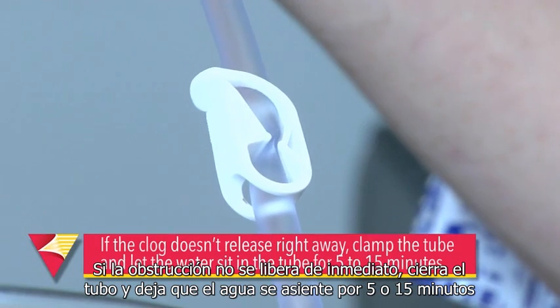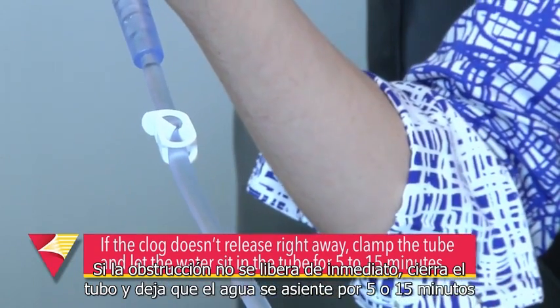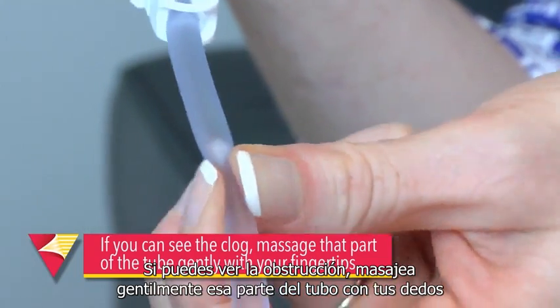Gently move the plunger back and forth to help loosen the blockage. If the clog doesn't release right away, clamp the tube and let the water sit in there for 5 to 15 minutes. If you can see the clog, massage that part of the tube gently with your fingertips.